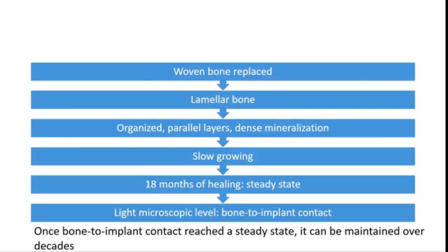That again depends whether you're placing an implant in the mandibular jaw or the maxillary jaw. Mandibular, we may have to wait for less time compared to the maxilla.